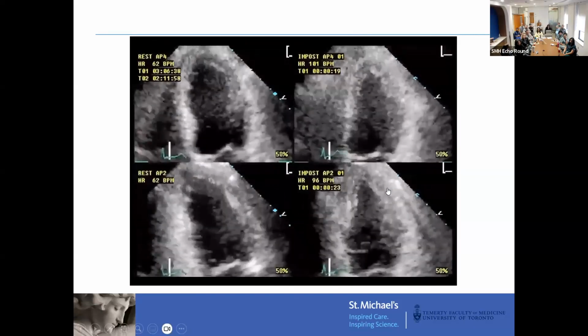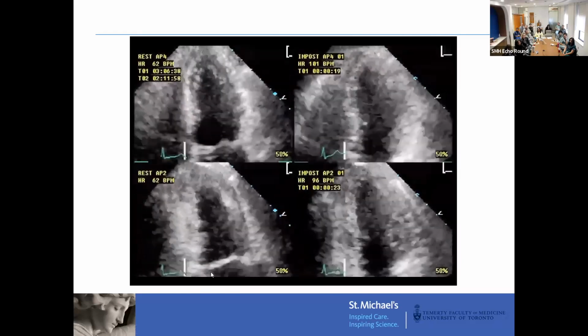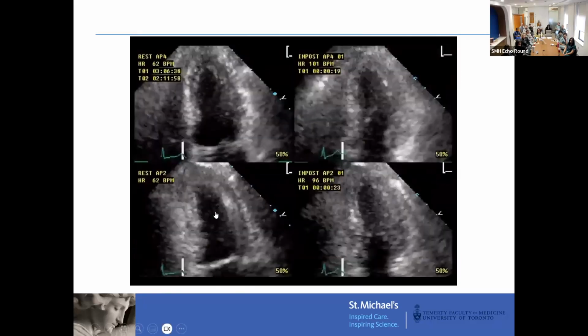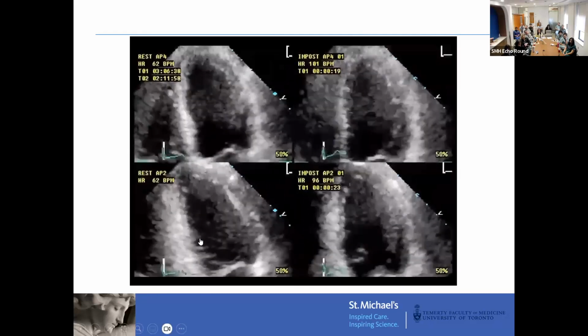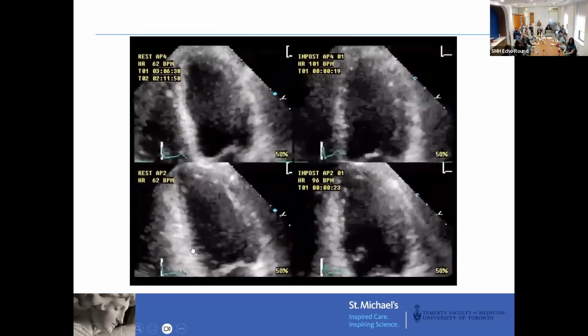It's not quite a great example of the high-risk features here, but these are also some wall motion abnormalities. They're a bit more subtle, but here the basal segments are a little bit worse. Yeah, I don't think it's projecting quite as nicely here. Yeah, and you can see the inferior basal segment is there. But what I want to bring your attention to is that this inferior segment is often overcalled. What you're trying to focus on is whether or not that wall is truly thickening, or is it just hypokinetic. And here there are some signs that it might actually be thickening.